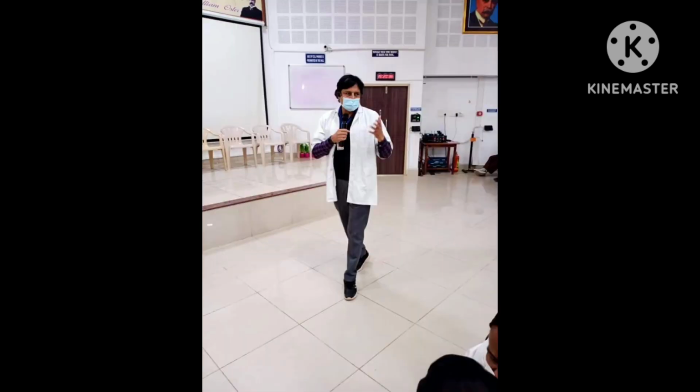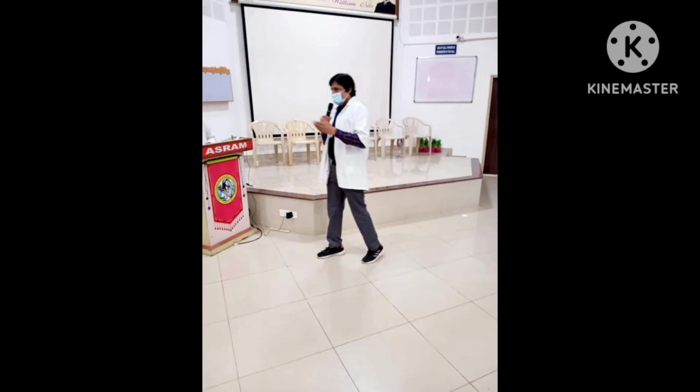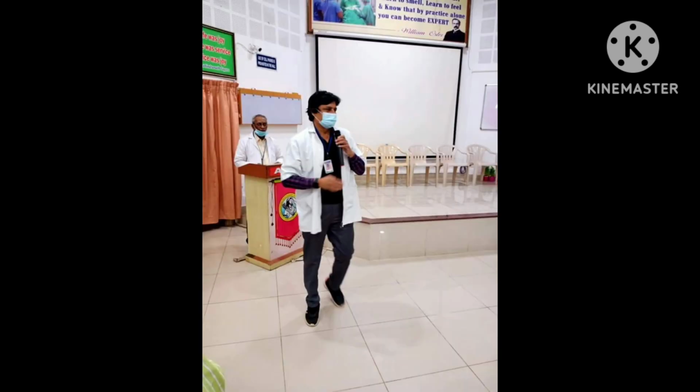Which gas is used, either carbon dioxide or helium? Several aspects of carbon dioxide or helium as a driving gas in intra-aortic balloon pump counterpulsation were reviewed and investigated, and carbon dioxide seems to be significantly safer than other gases but not benign.